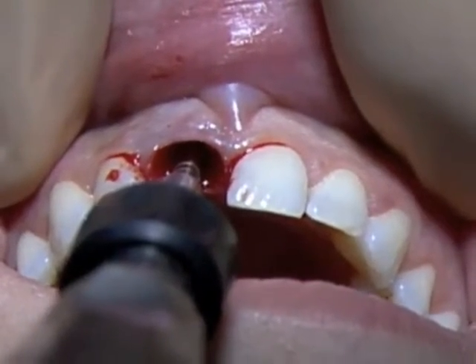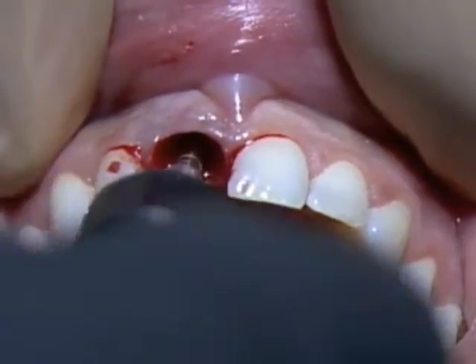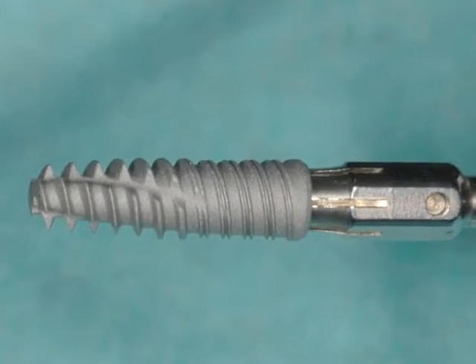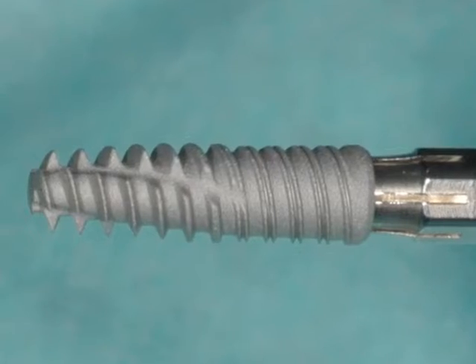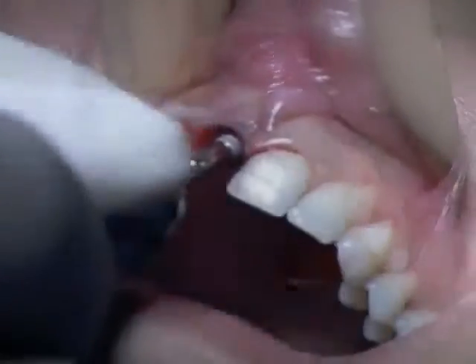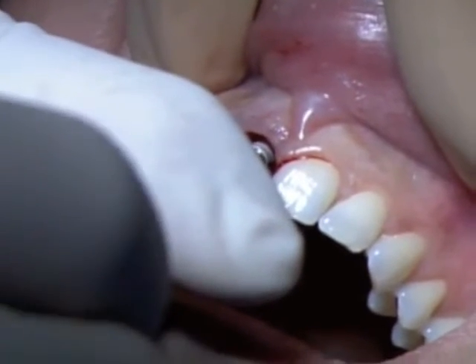We see here the three-dimensional positioning of our final osteotomy in order to place a 3.5 by 13 millimeter In-Kone from Teca France. You see it here, the aggressive threads on the apical part helps us stabilizing our implant with 70-80 Newton centimeters. I do not like to use rotary instruments.